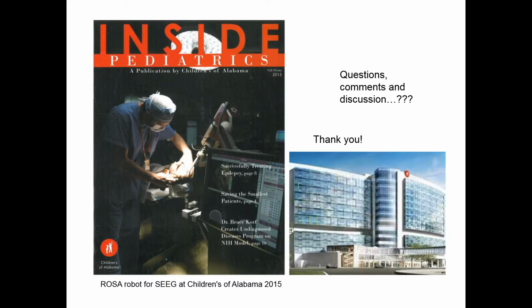So our initial strategy, I think, was 8 electrodes on the left and 3 on the right. Well, sure enough, as soon as we looked, it was coming from the right. So before we took him any farther, we took him back to the operating room, I don't remember, 3 days later, something like that, and added another 5 electrodes to the right. So we had something like 6 on the left and 9 or 10 on the right. So we had a lot of electrodes in that kid. So yeah, you definitely can get fooled.